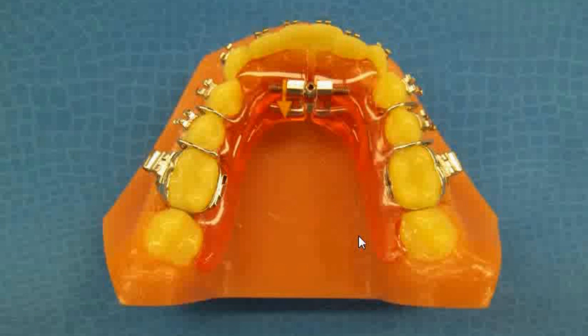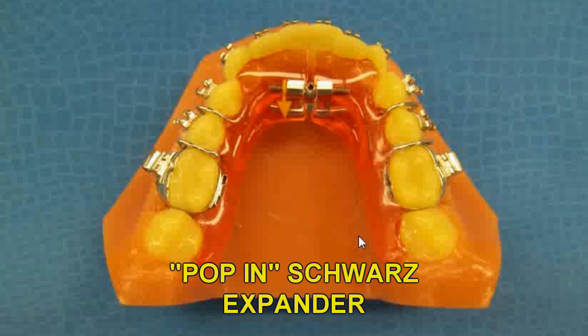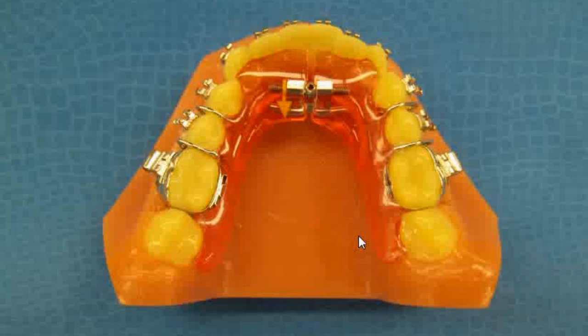As long as you're in at least an 020 stainless steel wire, you do not need to have the patient wear the appliance as a retainer after the expansion is completed. If you're in a smaller wire, the patient should wear the appliance until you get up to an 020 stainless steel wire. The pop-in design can be very helpful to allow you to quickly widen the arch a couple of millimeters to gain any additional space you may need without having to remove the bands and brackets. This appliance design can be used on the upper or the lower arch.